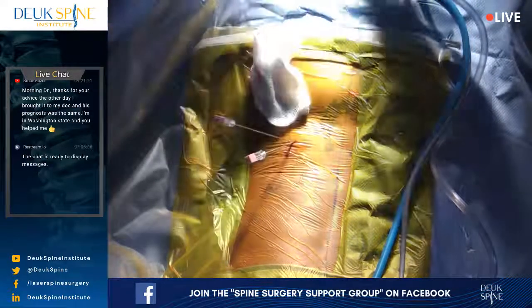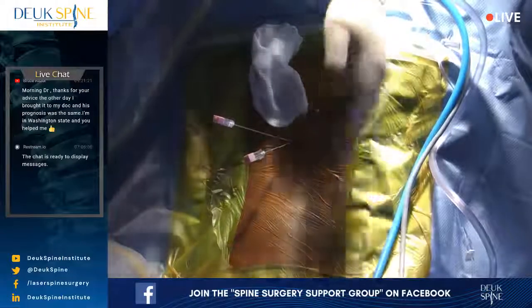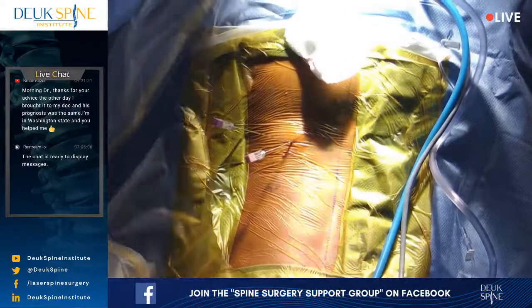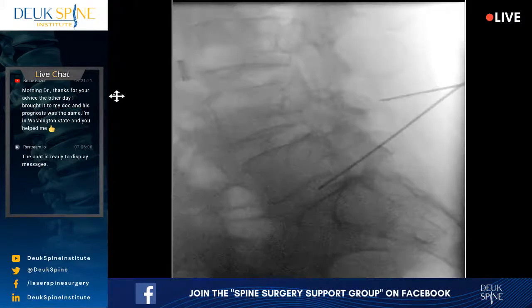And if you watch that fusion, remember we made a big cut in the skin, dissected all the tissue, moved it over, peeled the muscles off the spine. We're not doing any of that with the laser surgery. That's one of the reasons it's so much better surgery. We got to get to 4-5 and line that up, please. You're doing great, okay? I'm just talking. You're going to get to watch this when you're done, and you'll go back and say, okay, really cool.